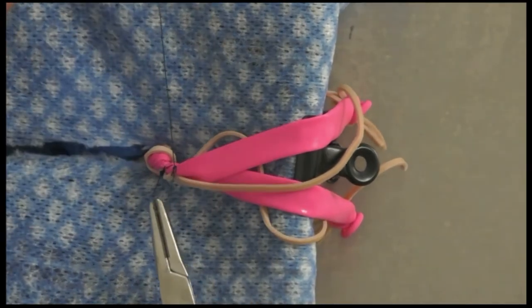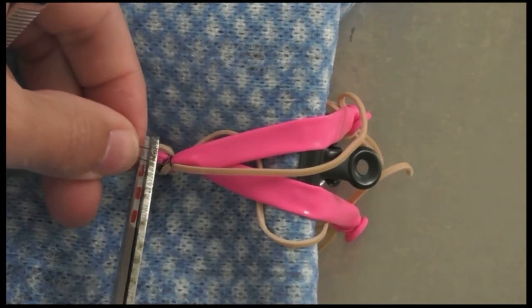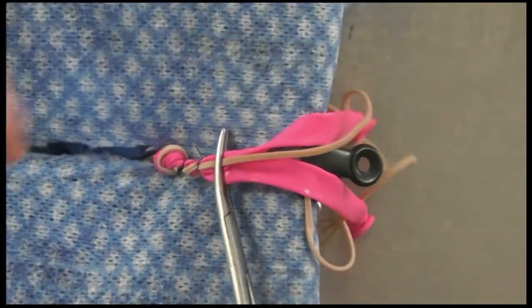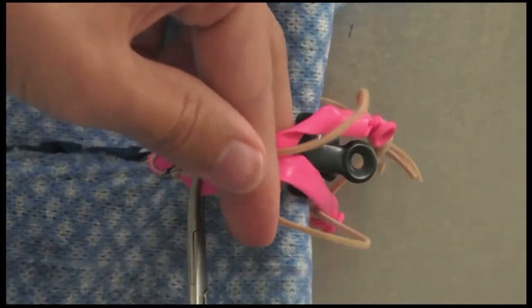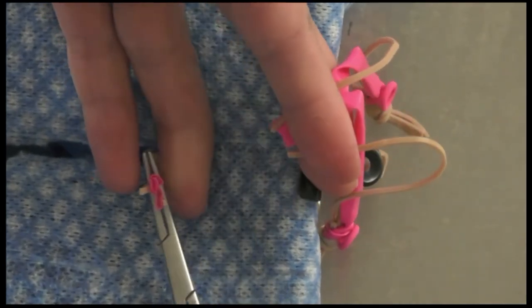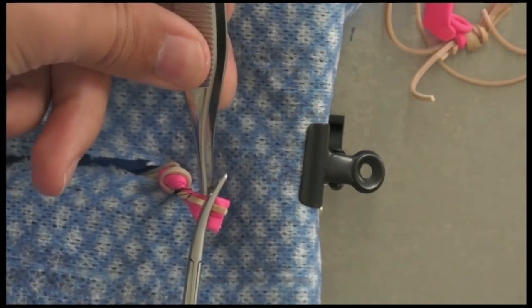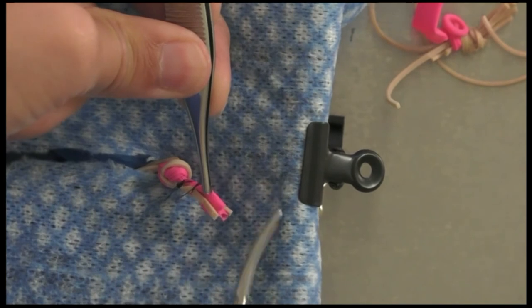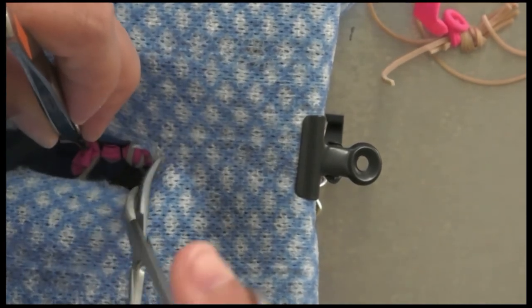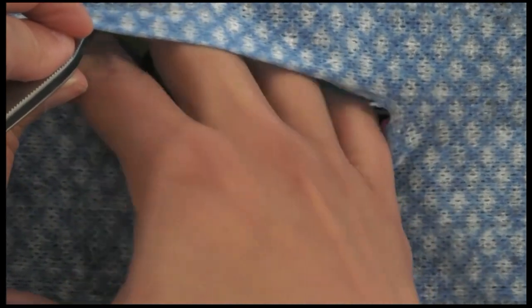Because the uterus can be very friable, it's recommended to avoid using hemostats until after your ligatures are placed — sometimes you can just saw right through the tissue with your hemostat. Apply the hemostat to your structure, then cut distal to it — usually with a scalpel, but scissors work here. Grasp distal to your ligatures with thumb forceps, then observe it before you let it go. Observe it out of the abdomen and then also in the abdomen.